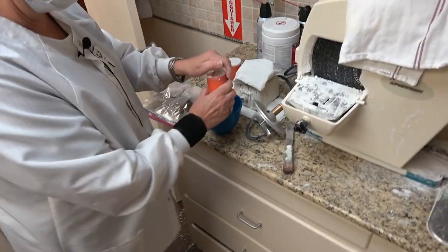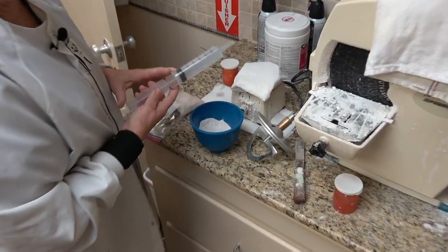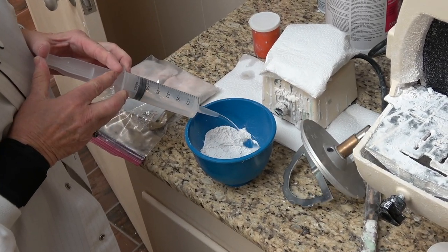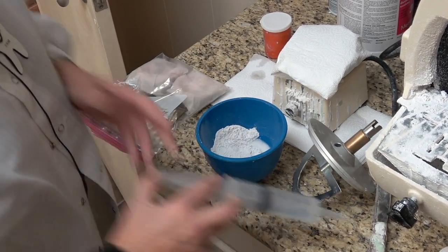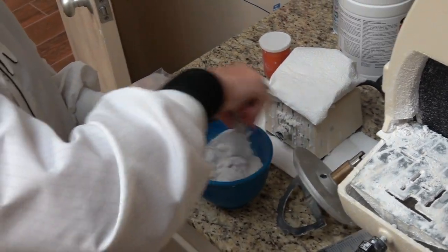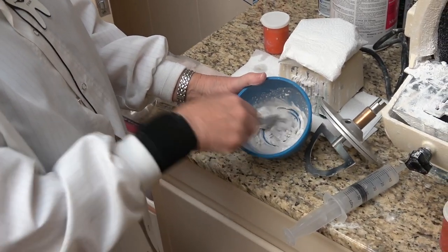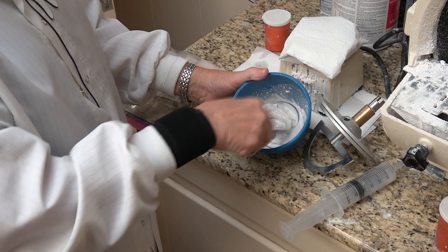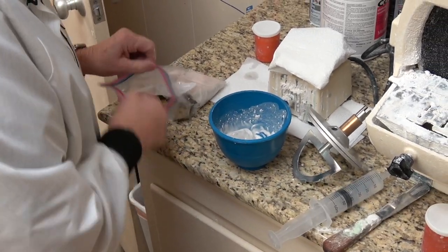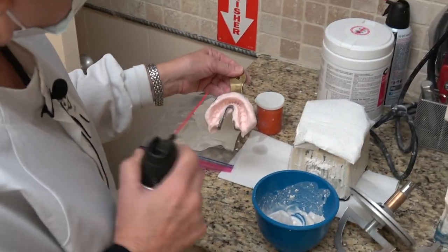One of these syringes to 20 cc's of water, and the mixture is going to be perfect to pour the impression. I'm going to pour one at a time. I'm going to dry them out a little bit because I don't like excess water, but I do like a little bit of water.